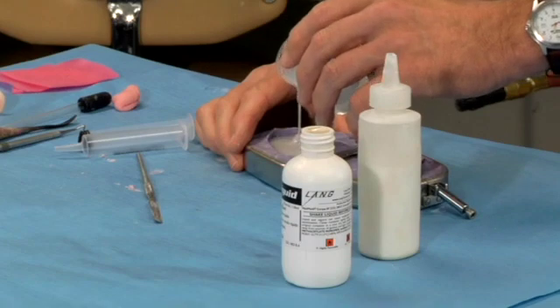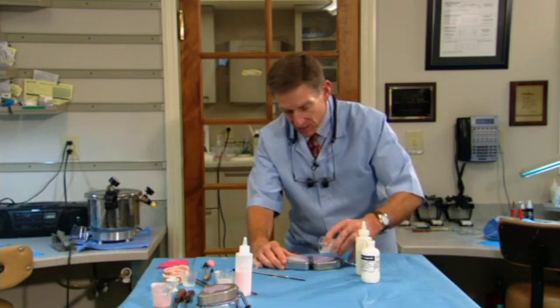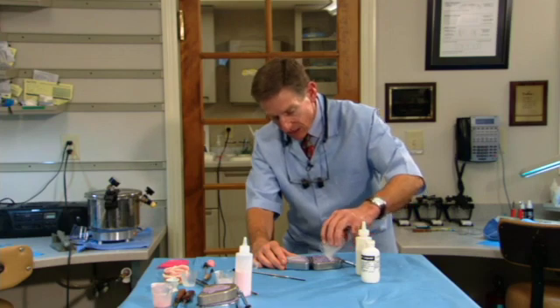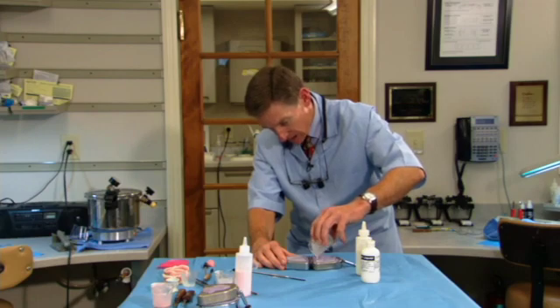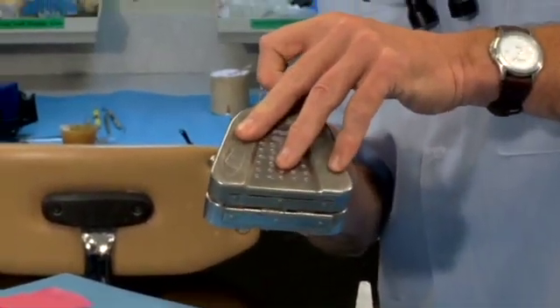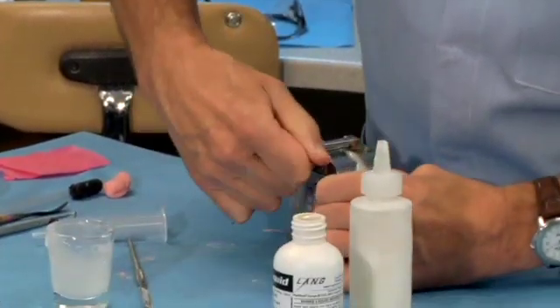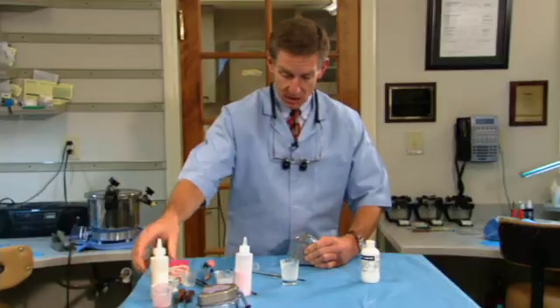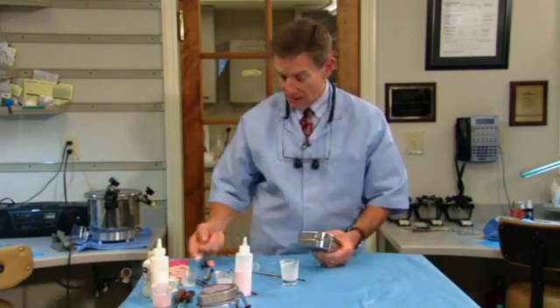If we were making a radiographic guide, a scan guide, we would incorporate a radiopaque material into this, and we would use a different amount of barium sulfate in the teeth than we would in the other areas. I'm going to close this down. Once again, I'm hoping for a little excess. Now this is the same jig that we would have made our duplicate denture in. Now we're going to use it for a clear duplicate.